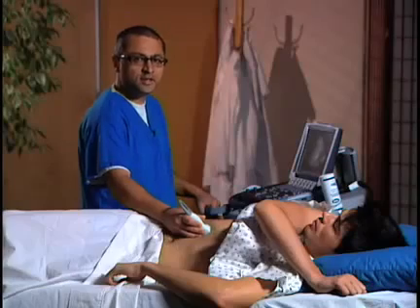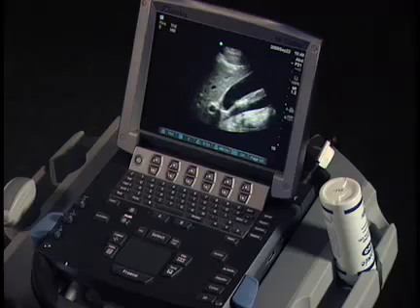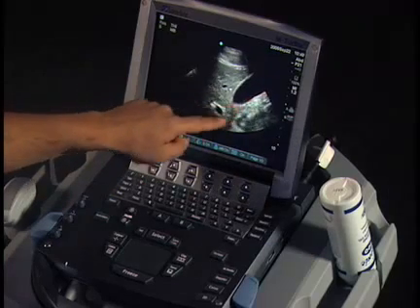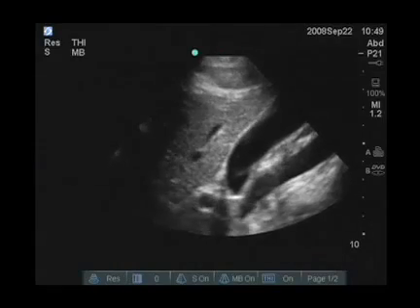A more advanced area that you may want to look at is actually measuring the bile duct. That's a pretty straightforward procedure. First thing you do is, again, find that exclamation sign, and again we see it here with the gallbladder in length. We see the portal vein, and just above the portal vein lies the bile duct.